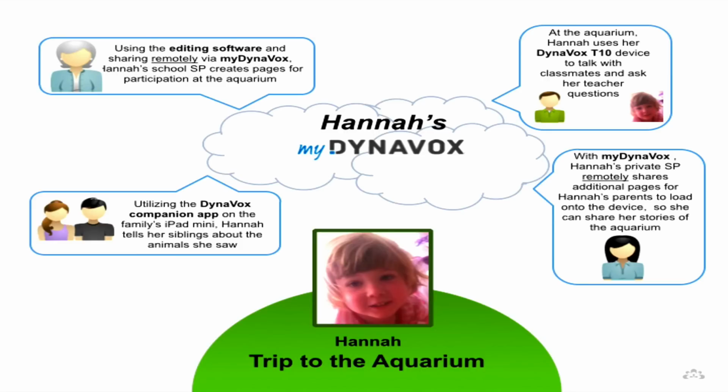In the bottom right-hand corner, we have an example of Hannah's private speech pathologist using her Compass editor to make some additional pages for Hannah to use at home. And Hannah's parents are going to load them onto the device. So the speech pathologist would be sharing those pages to Hannah's MyDynavox account so that they can go onto her T10. And also you can see in the bottom left-hand corner that Hannah has the companion app.